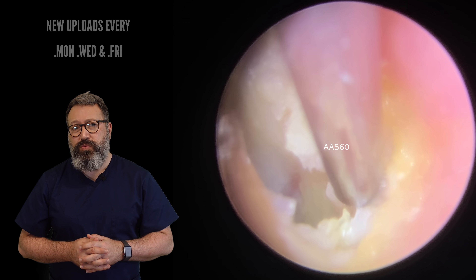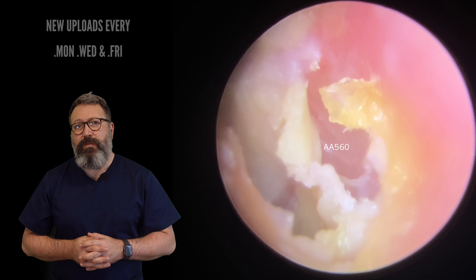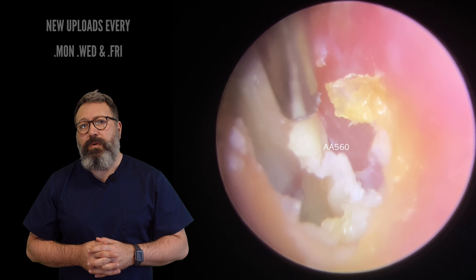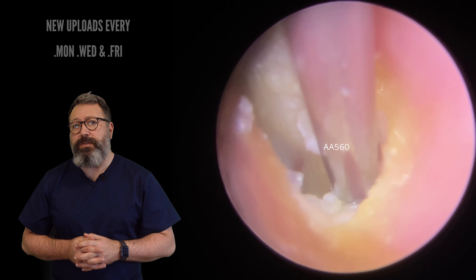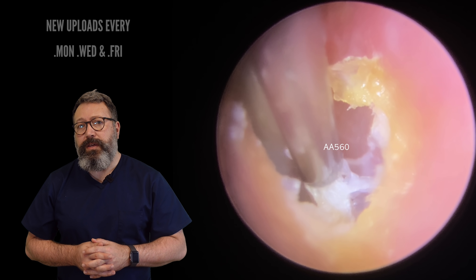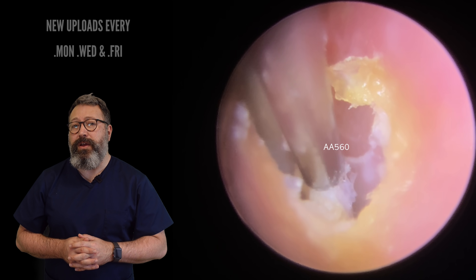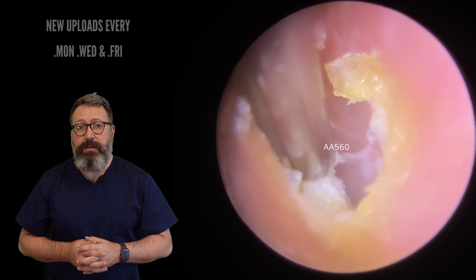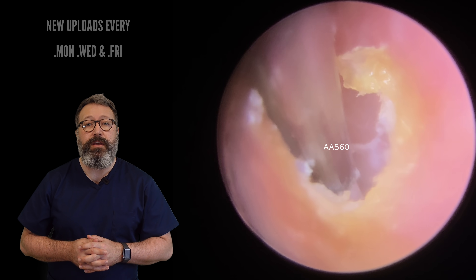Just taking away the looser material first. You can see I'm just working around the outside edge. It's all detaching very well there. Now what we will do in a second is pop a little bit of olive oil in here, because what we don't want is for it to pull too hard on the eardrum itself — it's a very, very thin membrane.